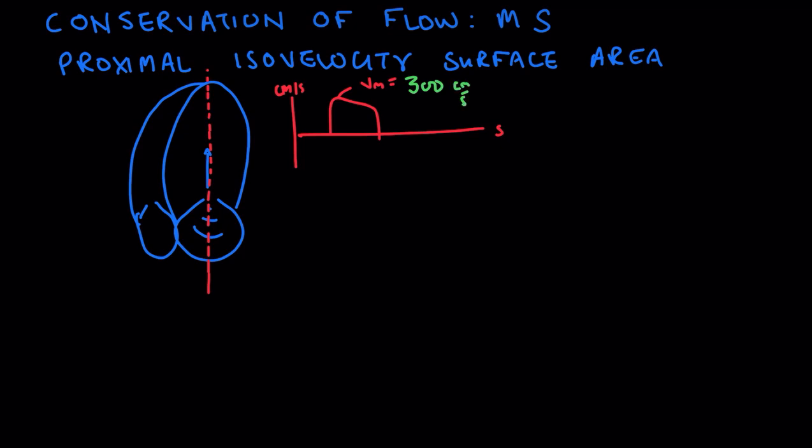centimeters per second. I'm going to add some color to our apical four-chamber view. I'm going to draw that jet of blood that rushes at Vmax in green. Then the blood, as it's accelerating, I'm going to pick a particular hemisphere. So right there, let's say we measure this hemisphere out at a radius of 1 centimeter, and the aliasing velocity, in other words, the velocity of the blood right at this hemisphere, is 40 centimeters per second.